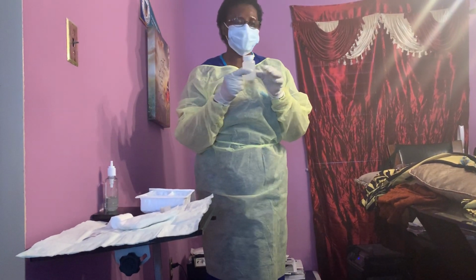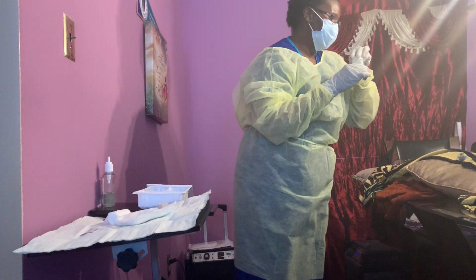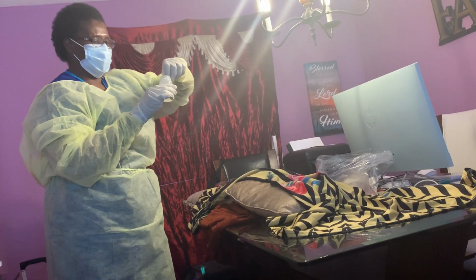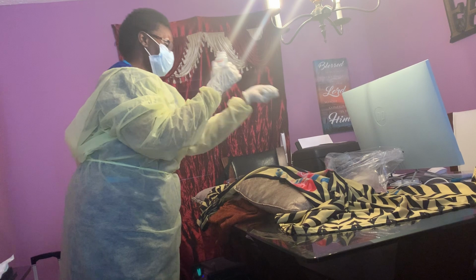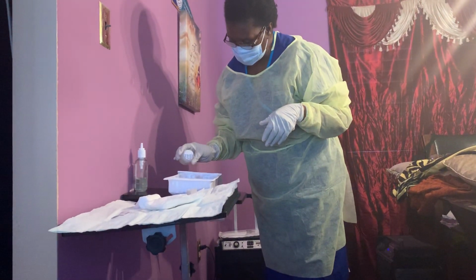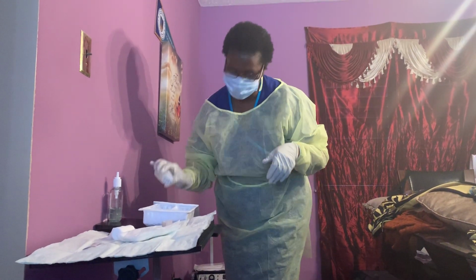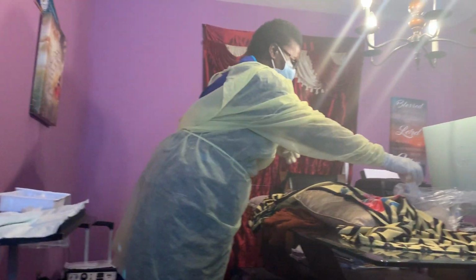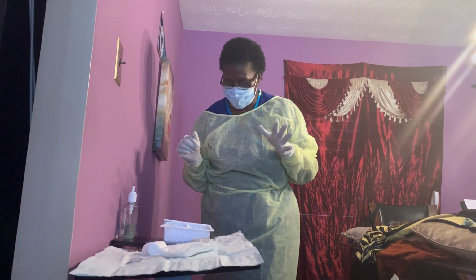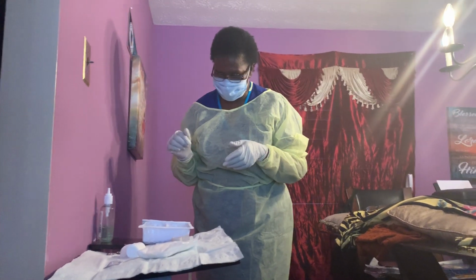I'm gonna take it out and I'm gonna open it. So I'm gonna open it, trash the cover, and then I'm gonna open and put in the trash. And then I'm gonna come pour my sterile water for everything. Assume everything is poured in. Make sure it's not splashing, and then I will trash. After that is done, I assume I have my 60cc syringe, sterile syringe.